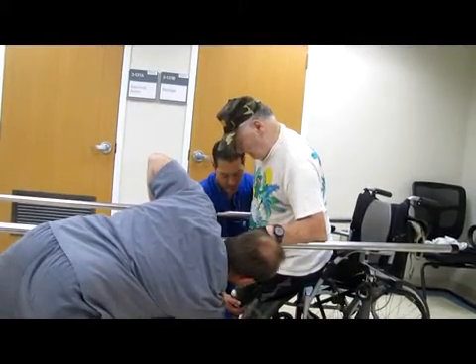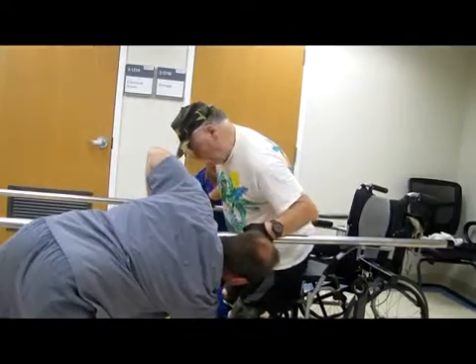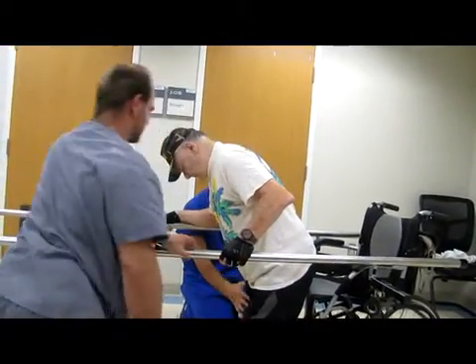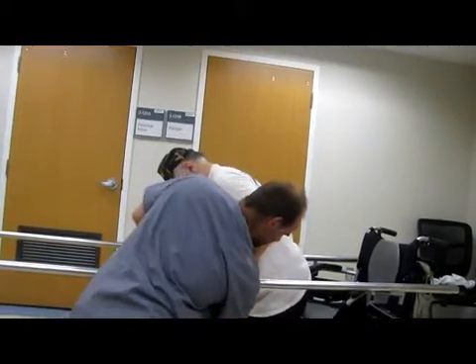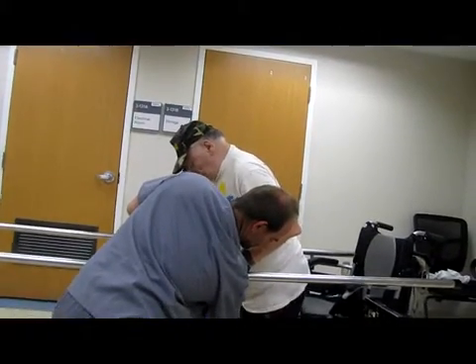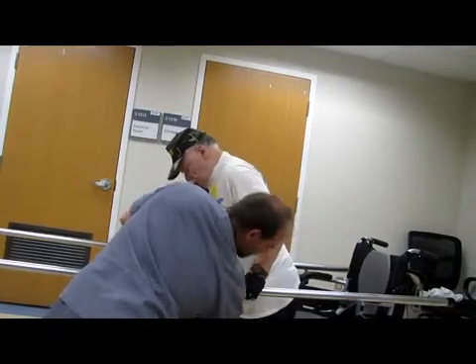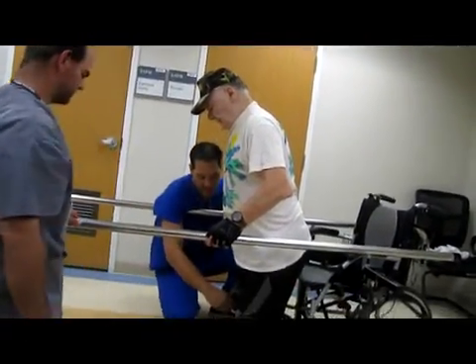This seems loose, certainly. The right side one? Yes. Now it seems a little bit more stable. Okay. Can you put your left foot backwards a little bit, behind you? Straighten up. Okay, now we want to stand before we can walk. Just stand here and get your balance.